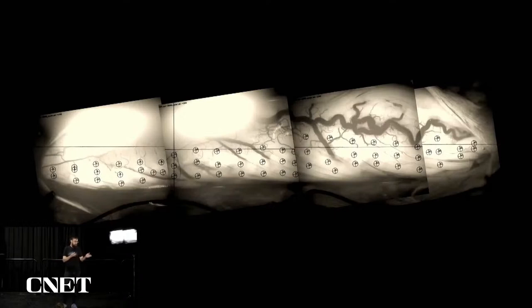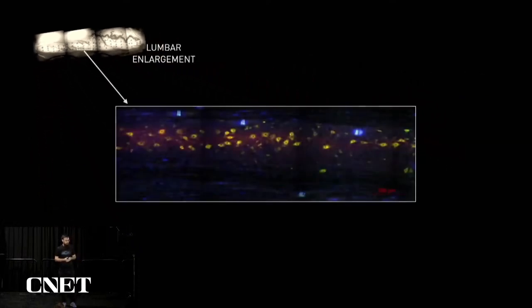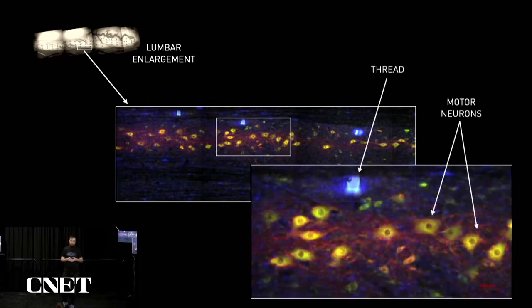Here you can see a view from the R1 robot. It's a targeting view, and we've placed electrodes across many millimeters of the spinal cord. And the R1 robot is able to insert those electrodes deep into the ventral horn, into motor pools, in very close proximity to lower motor neurons. This is important because it allows them to have a localized connection to those neurons and activate very precise movements.